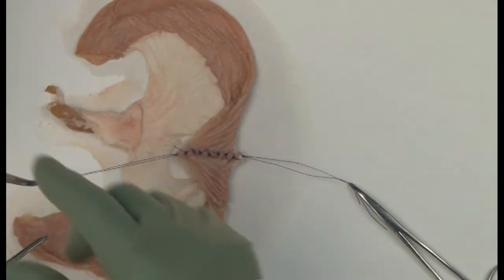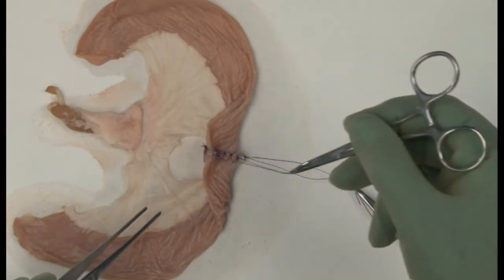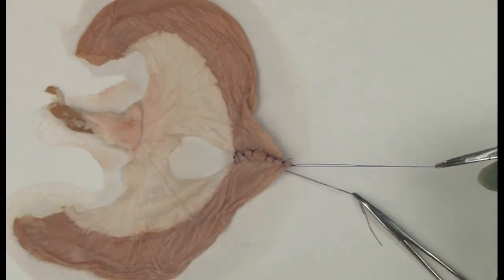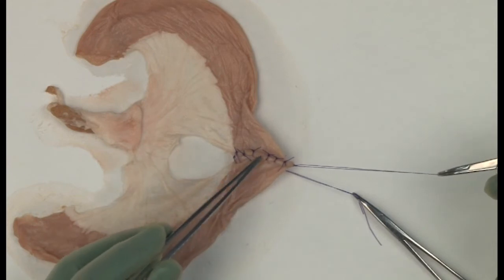Having inserted the whole posterior wall, return the bowel to its normal position, checking there is no gap between sutures. If there are, as here, a further suture can be placed.